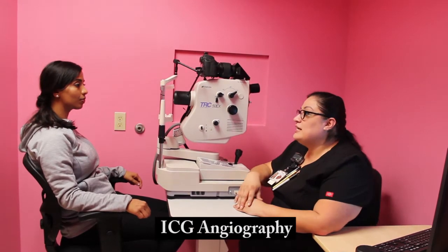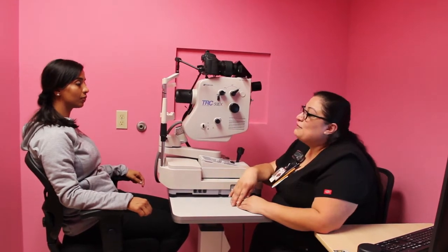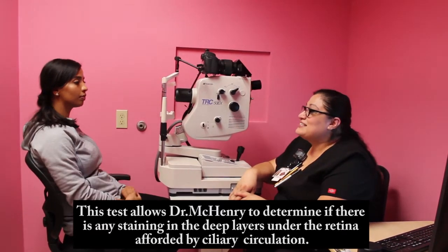This test allows the doctor to see if there is any leakage inside or behind of the eye. In order to perform this test, I will need to find a good vein in your arm and to inject the dye. This dye is similar to the MRI dye.